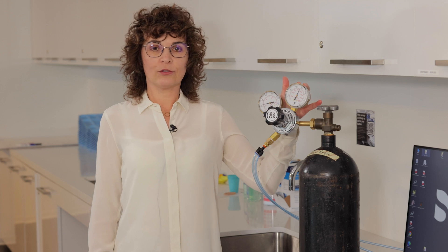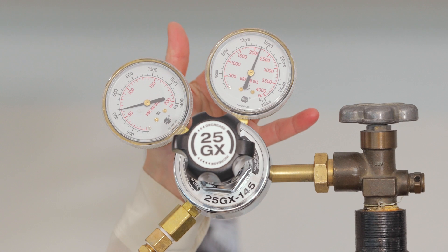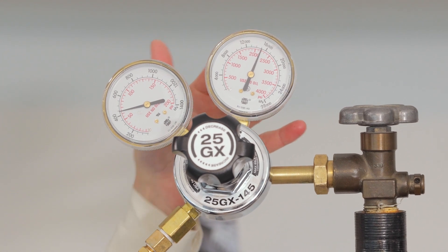We recommend not to dip below 200 psi. If you notice that your tank has less than 200 psi of gas left, please change it.